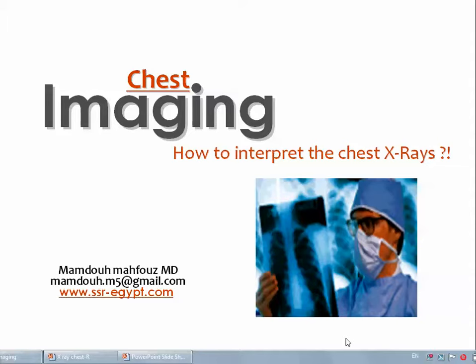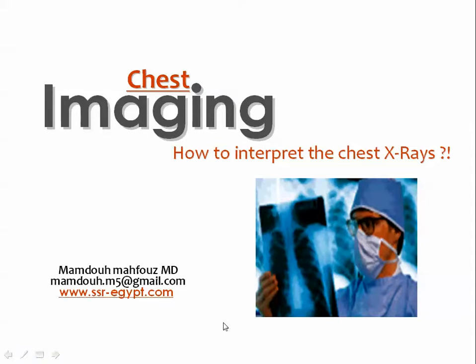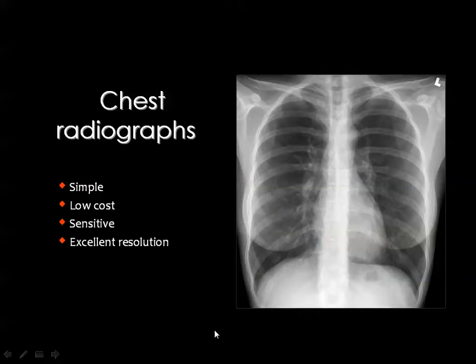Then the interpretation of a chest x-ray is, let us say, not that difficult, but it needs some special protocol or a simplified way in order to reach most of the values of this very simple radiographic technique.